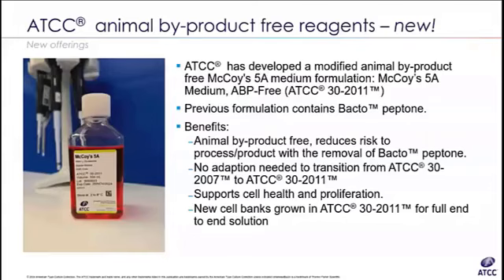So, Tiffany, does the new McCoy's 5A ABP-free medium still need to be supplemented with fetal bovine serum? Thanks, Brian. The new McCoy's formulation is the same as the previous formulation, except for the removal of the bactopeptone. So that means it does still need to be supplemented with serum.